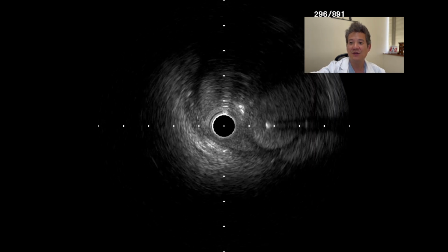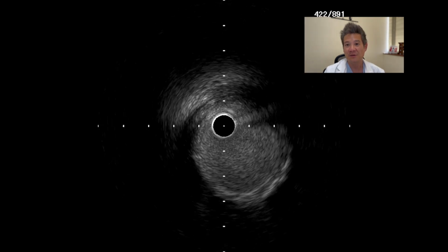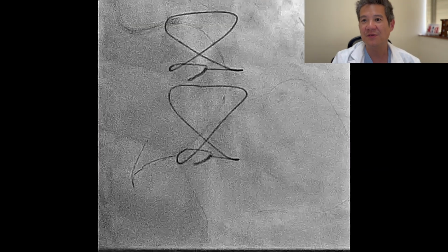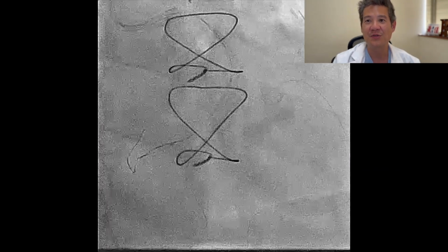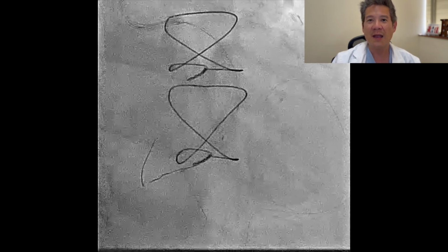So after this, I pushed a microcatheter, the fine cross, down to the subintimal space on the first wire. I pulled out the wire, put on an indeflator and pulled negative onto the fine cross. This is to suck the extraplaque blood out while I'm doing stenting. I waited for 2 minutes before I put a stent down, and you can see the fine cross microcatheter is the dark spot there, and you can see a stent coming down. And this I call extraplaque blood withdrawal stenting, EBW stenting.